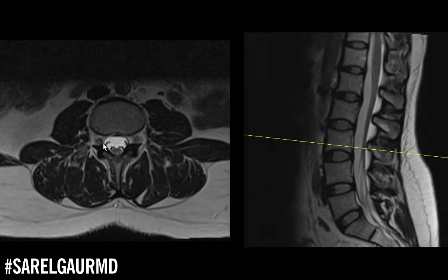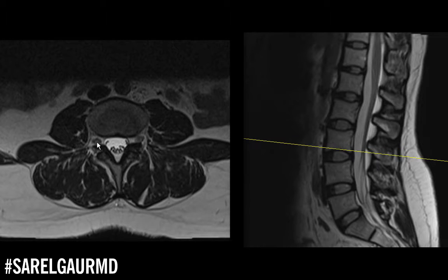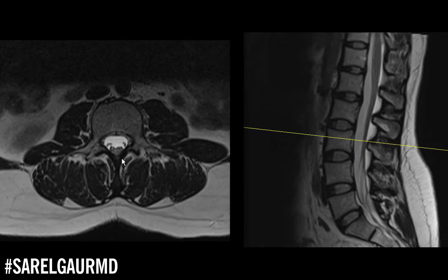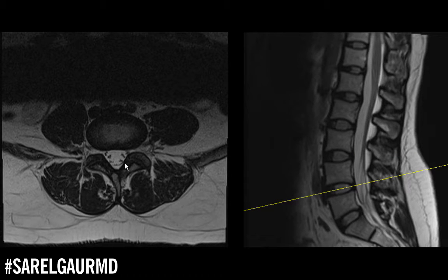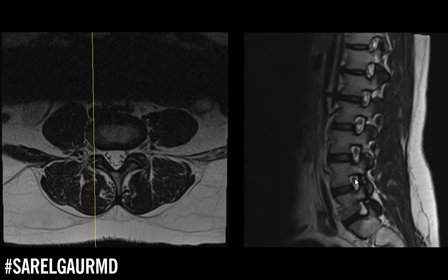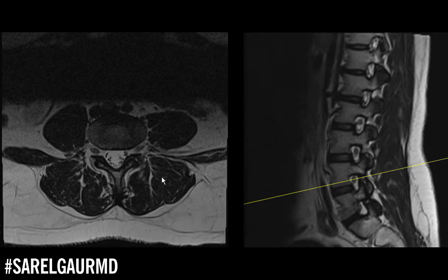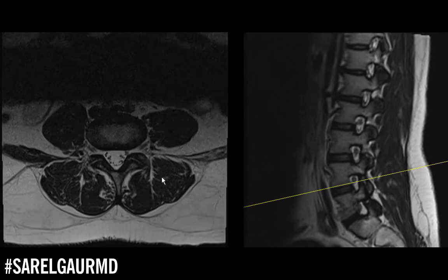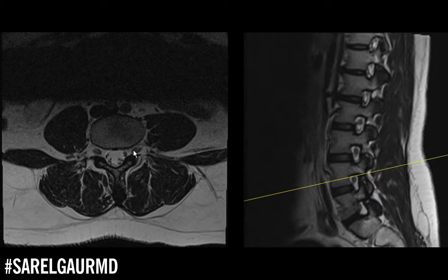These two nerve roots right here are going to combine and form this dark signal structure known as a spinal nerve. I'm here at the L4-L5 level, and I'm going to talk about how we name these nerves — there's a standard convention. I want to find the spinal nerve that's exiting at that level. On the sagittal, you can see the nerve actually exits slightly above the disc level, so I need to come up slightly to see it. Here's my nerve — this is the left spinal nerve in the neural canal.